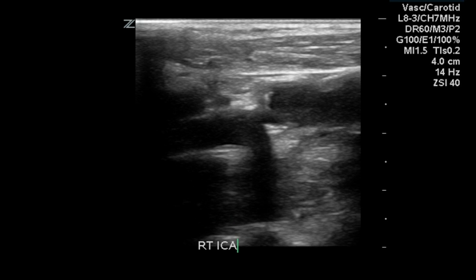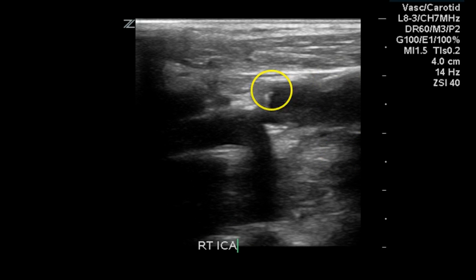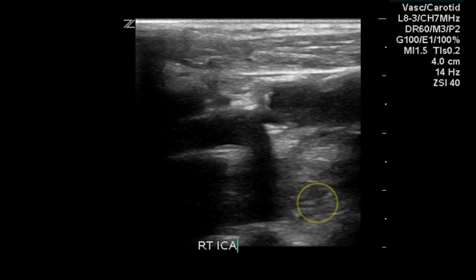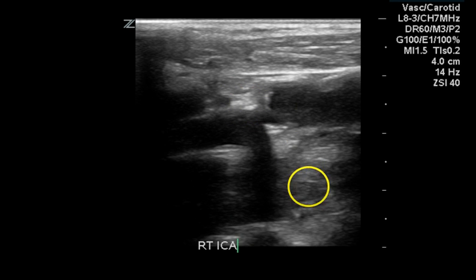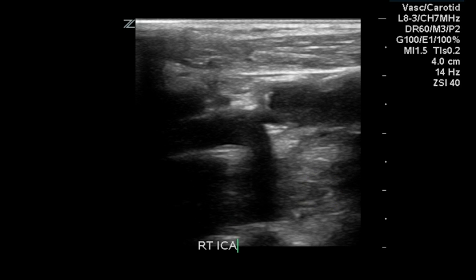The origin of the internal carotid artery on the right is demonstrated. Non-shadowing plaque is present in the distal common carotid artery, and we see some shadowing plaque in the proximal internal carotid artery.